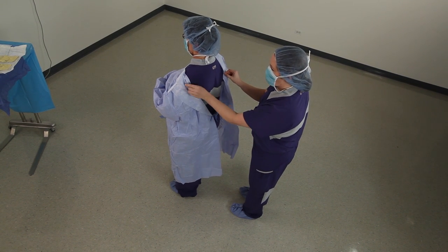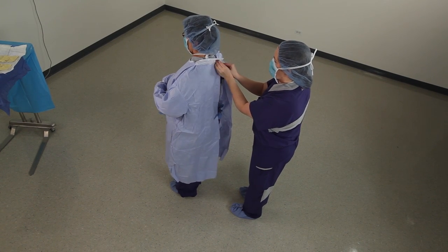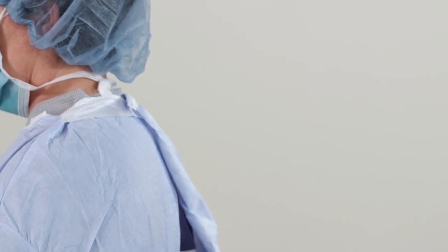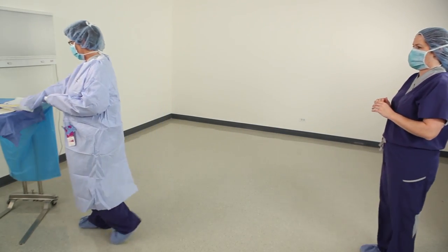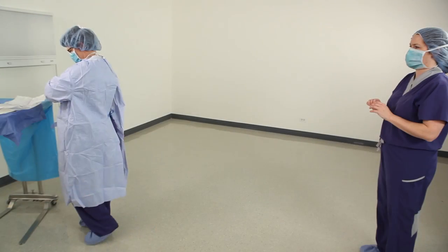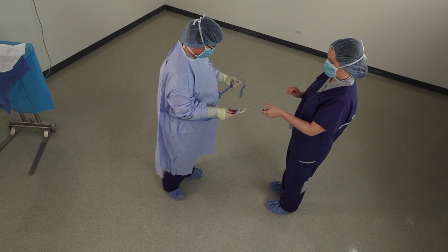Secure inside ties of the gown first, and then fasten the Velcro neck closure. To secure the front tie, the gowned individual should hand the transfer tab to the second clinician as shown.